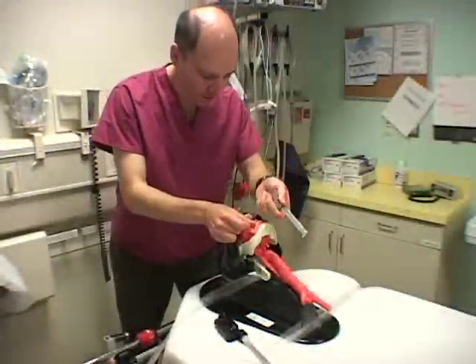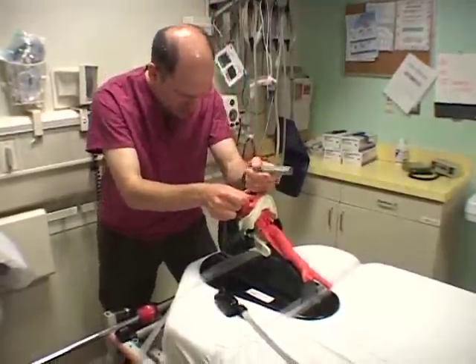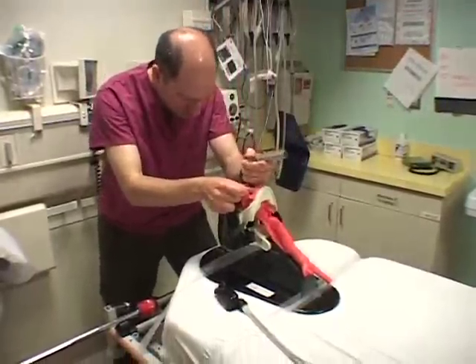Intubation with the Levitan FPS scope begins with exposing the epiglottis edge using a standard laryngoscope. The laryngoscope lifts the jaw and creates the open channel for the FPS. If a good view of the larynx and vocal cords is seen under direct vision, simply intubate using the FPS as a standard stylet.